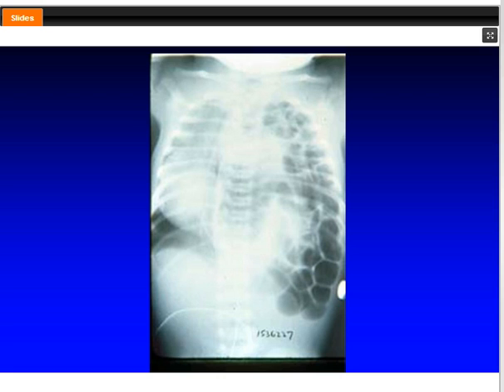This lung, I would argue, is a little bit more inflated than it needs to be, but you should always see some space below the heart border. And if you count ribs, you're probably going to get to 10 or 10.5 ribs in this baby. So again, sometimes you need 10.5 ribs, sometimes you need 7.5, 8 ribs. Depends on the baby, and it depends on the lung from that standpoint.